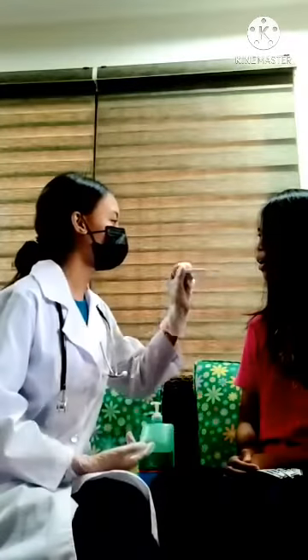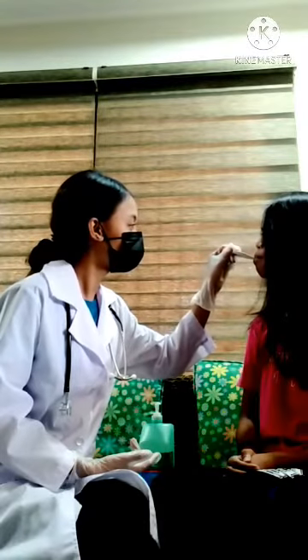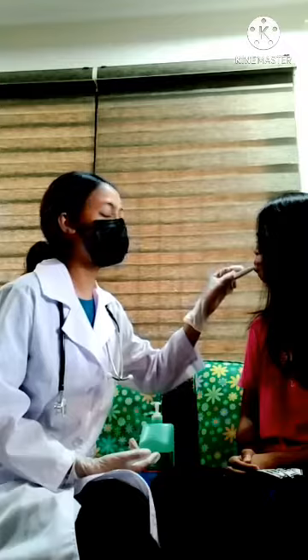And then after that, ask the patient if he or she is ready. Ma'am, are you ready po? Open your mouth po, ma'am. And then put the thermometer in the posterior sublingual area of the patient. And ask the patient to close his or her lips and wait to hear the beep. And then remove the thermometer from the mouth of the patient. And then dispose of the probe cover.